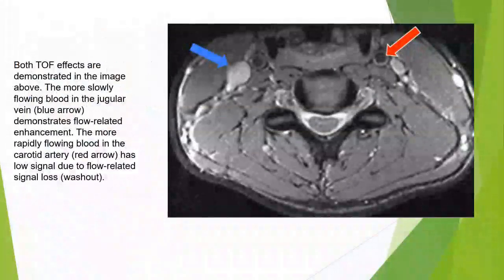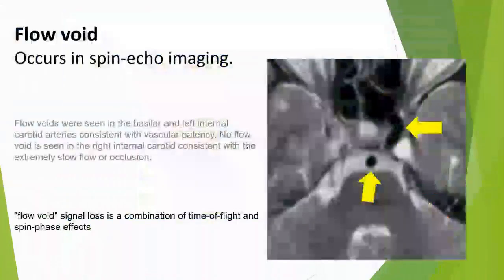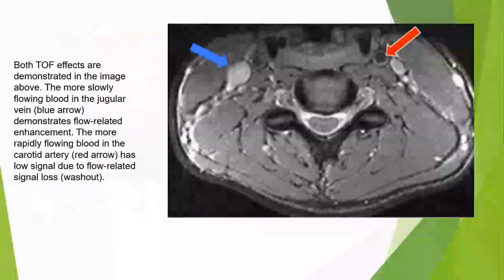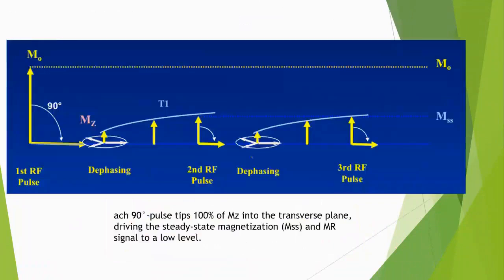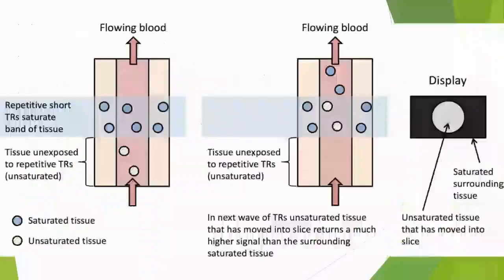Well, we were definitely talking about, as you may recall, the topic of time of flight, where you provide the saturation pulse and you perform saturation of the magnetization while the subject is stationary.